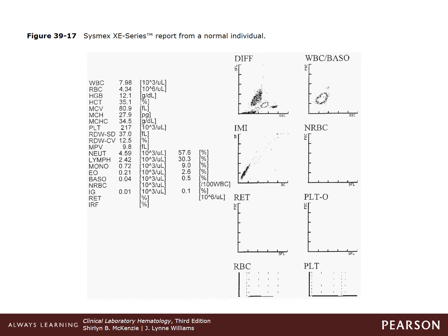The red blood cell count represents the number of cells that fall between 25 and 75 femtoliters as a lower discriminator, and an upper discriminator of 200 to 250 femtoliters. Likewise, the platelet count is determined between cells at a lower discriminator of 2 to 6 and an upper discriminator of 12 to 30 femtoliters.